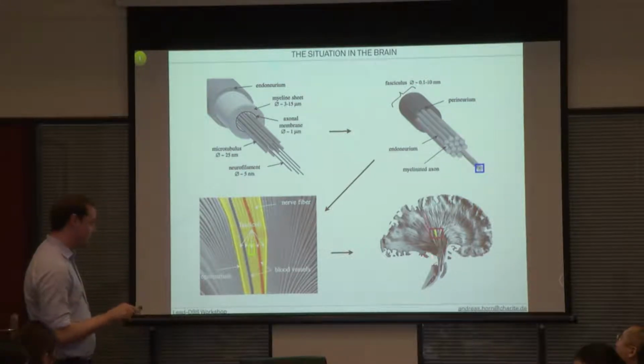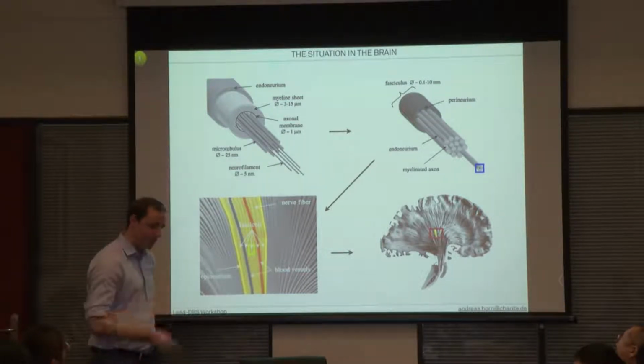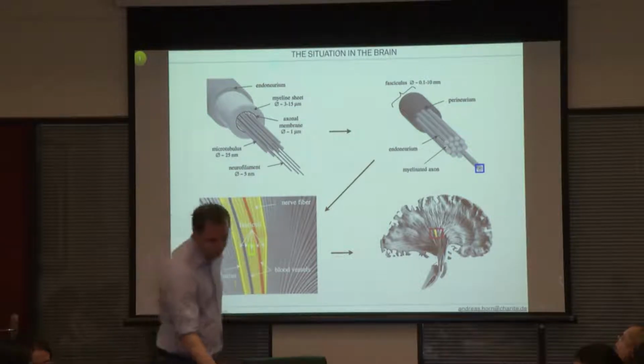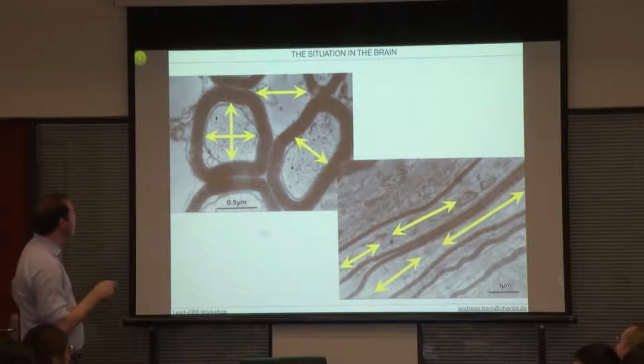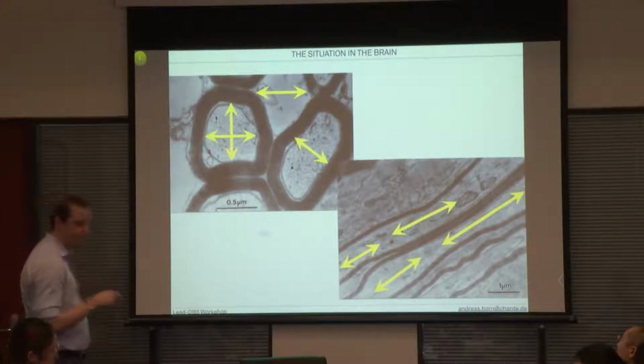The water is actually very organized in most parts of the brain. We have a strong hindered diffusion. So more diffusion in one direction than in the other. And you could see that the diffusion in this direction would be stopped by the membranes, but there's free diffusion along this direction, so you get stronger, more probability that the diffusion goes this way than this way.